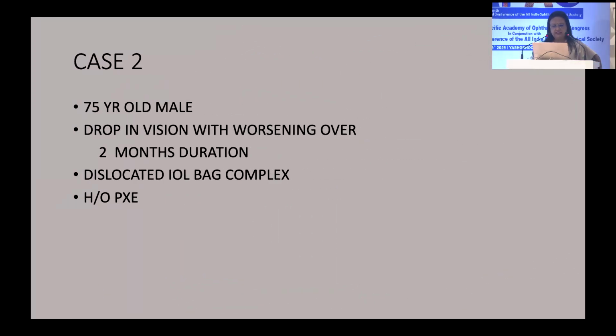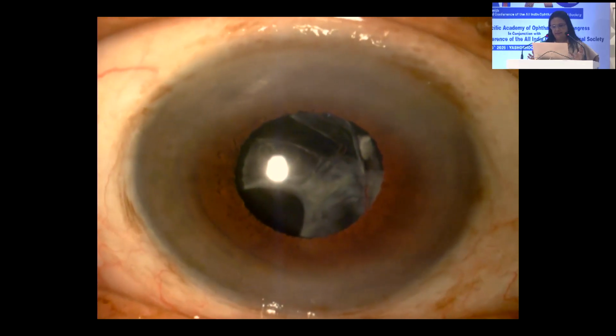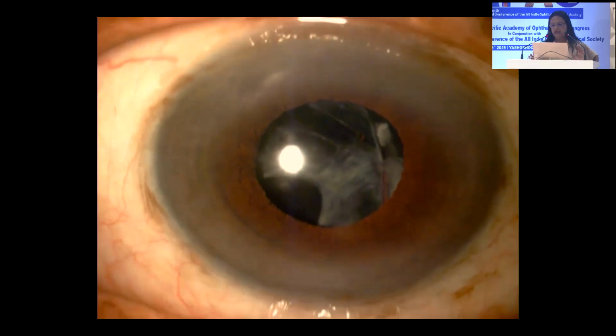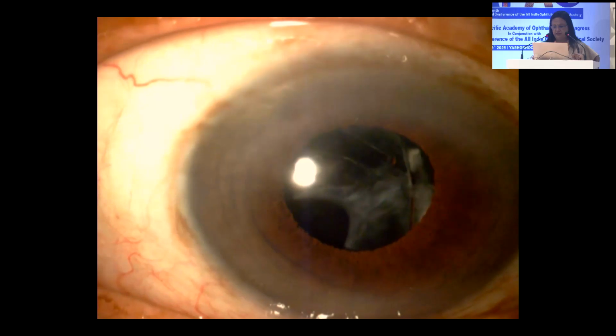The next case is a very similar case, again a 75-year-old male with a drop in vision which was worsening over a period of 2 months. We found this was a dislocated IOL bag complex, and this was a single piece lens, and you can see that the lens haptic optic junction is seen in the visual axis itself. So in this case, I decided to go in for a Hoffman's pockets.